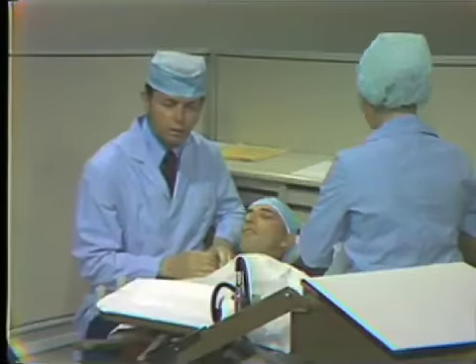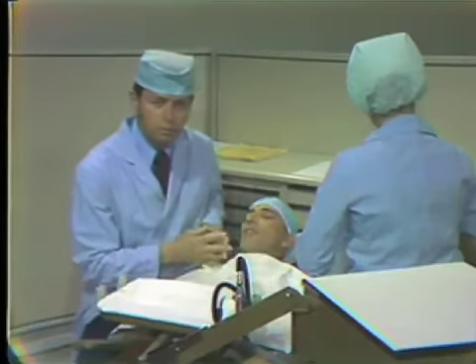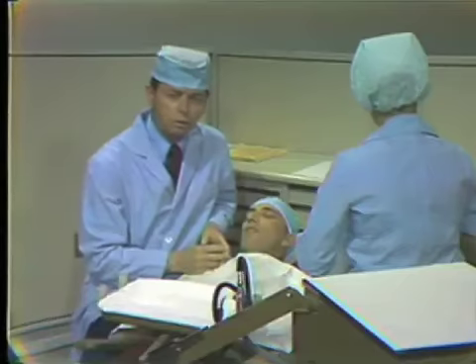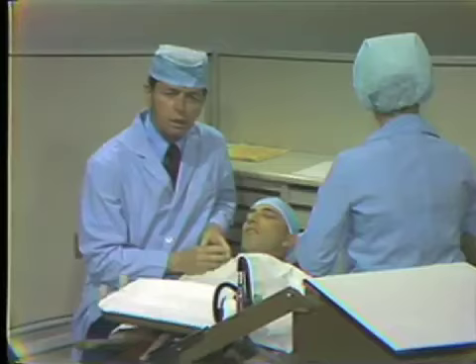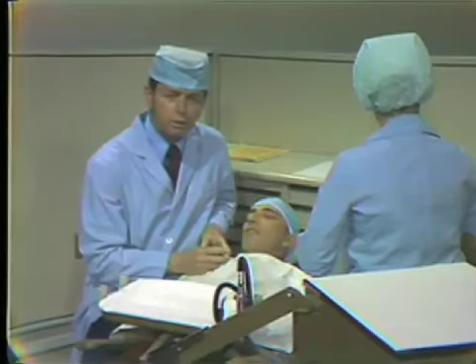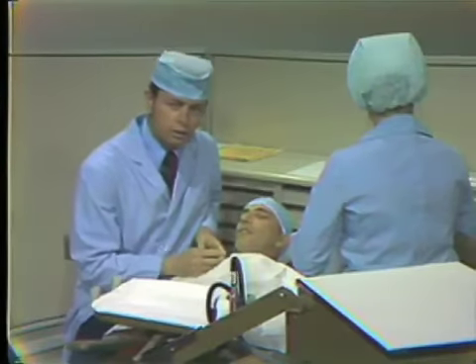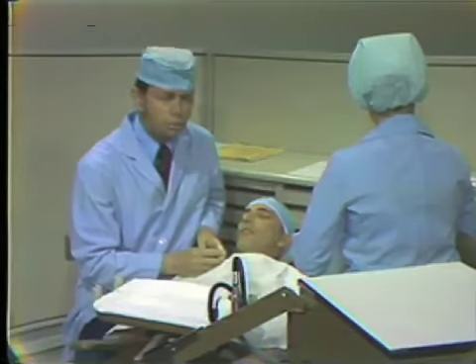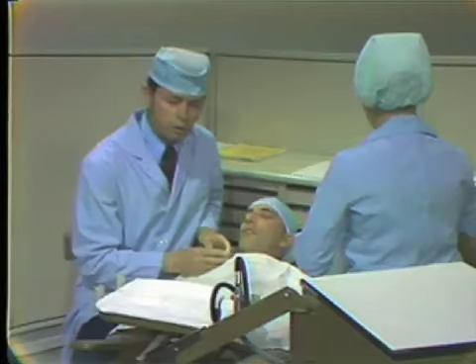Now, as we have our anesthesia, we'll begin the surgical procedure, but let me remind you that the purpose of this tape today is not to demonstrate the technique of a periodontal surgical procedure to you, but it is to demonstrate those things that the assistant can do to help us during the periodontal surgical procedure. We'll begin at this time again with the initial incision and the passing of the scalpel handle and blade, which again is somewhat different from passage of the regular hand instruments, and we'll begin at this time with that demonstration.